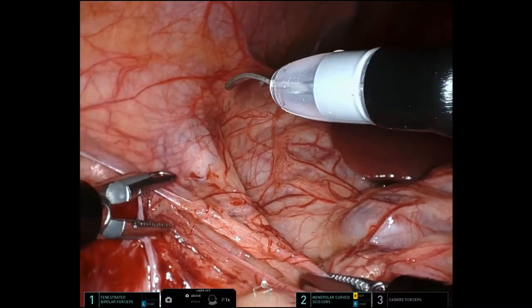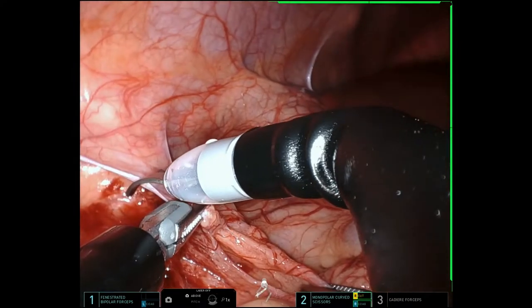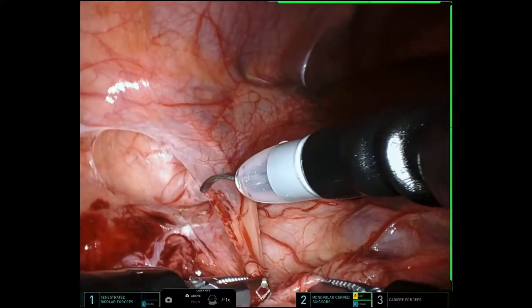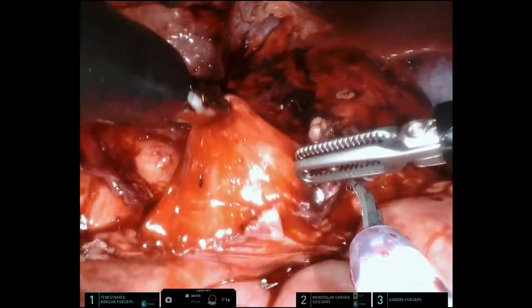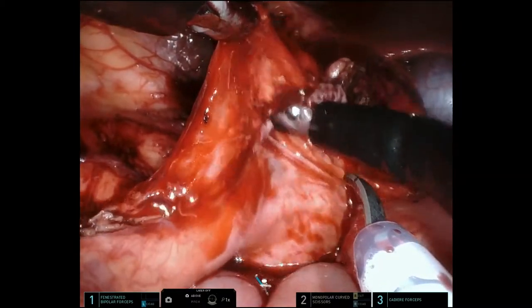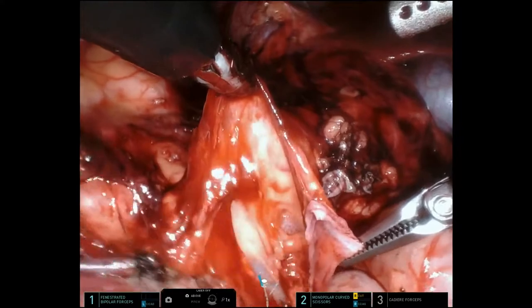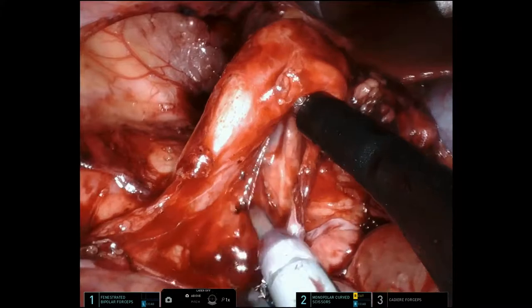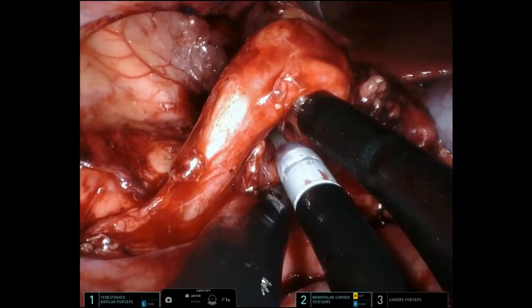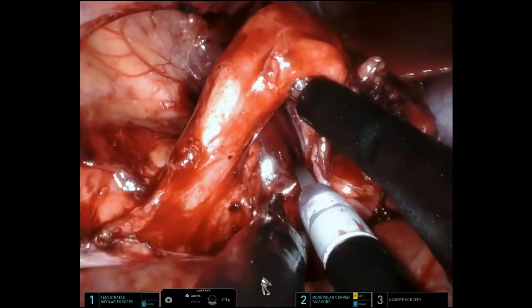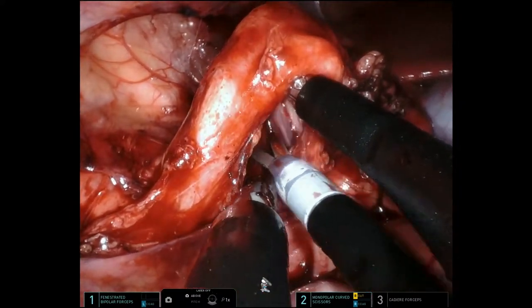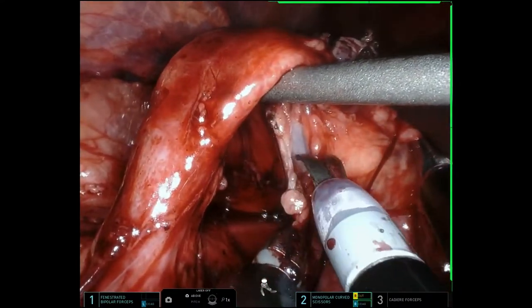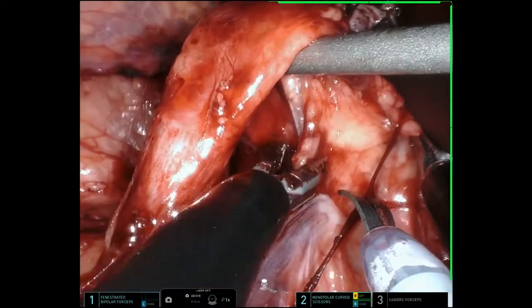First thing we do is reflect the colon along the white line to expose the retroperitoneum of the ureter and the kidney. One thing to point out is that this case is a lot more oozy than typical. I think it's because of not only how the injury occurred, but also the long-term development of inflammation from the foreign body ureteral stent. This is dissecting circumferentially around the ureter and now cleaning the posterior aspect of the renal pelvis. I do use a little bit more electrosurgery in this surgery than normal simply to try to minimize ooziness.